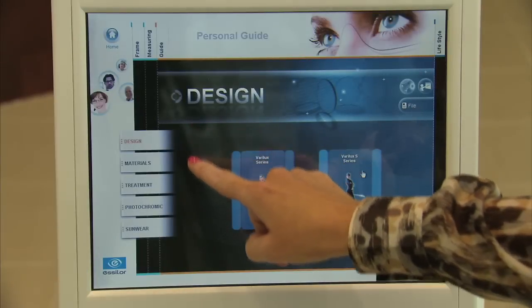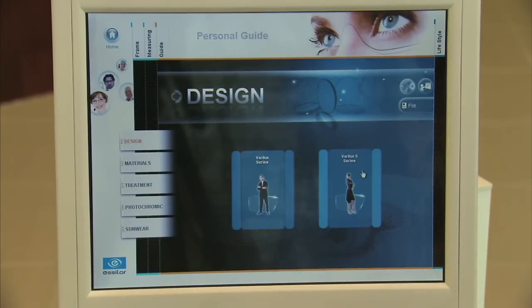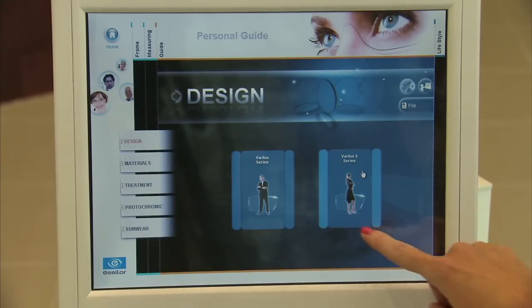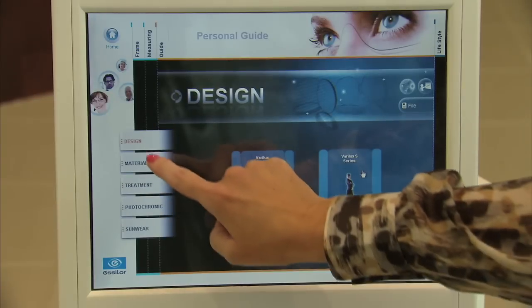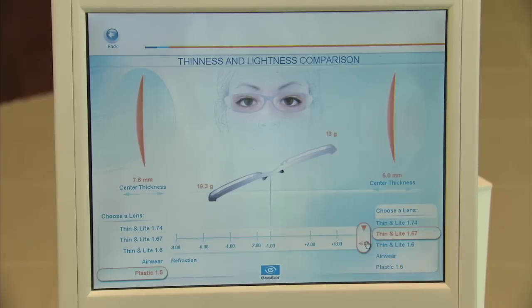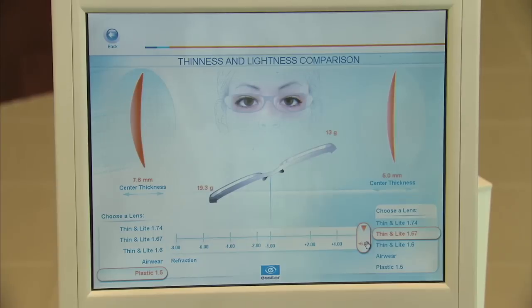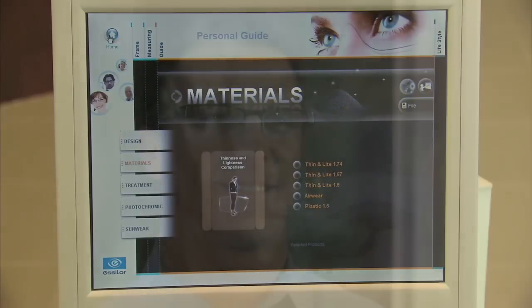Using the guide section, the ECP can educate the patient on common vision needs and solutions, as well as reinforce the personalized recommendation for the patient. Through the videos and demos, the ECP can show the patient the benefits of Varilux designs, Crizal no-glare lenses, high index materials, and Xperio polarized lenses. Using the patient's own recorded measurements, the demos can be customized for the specific visual needs of the patient.